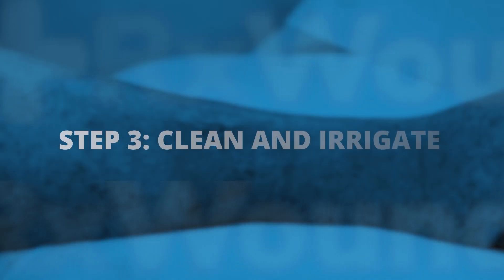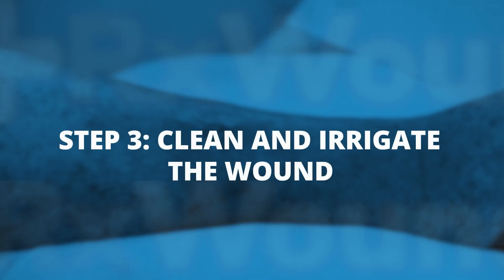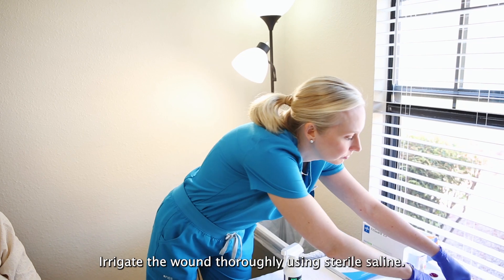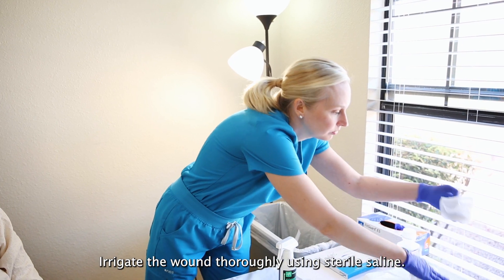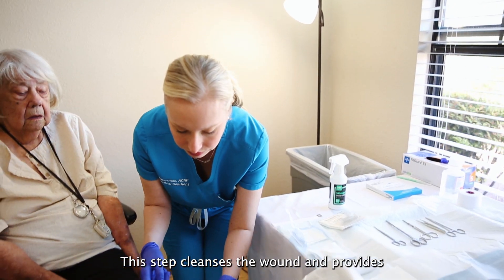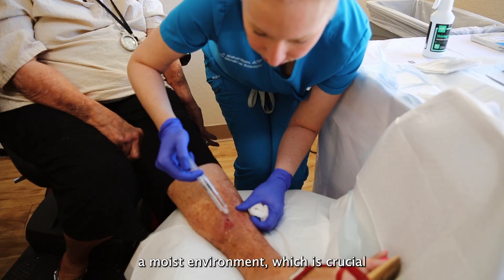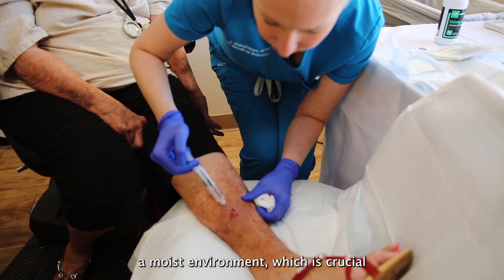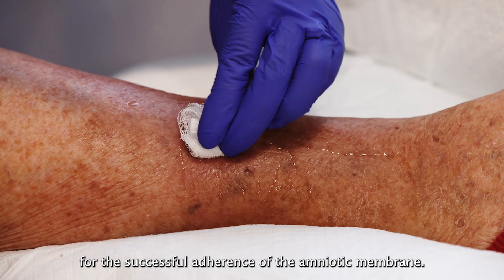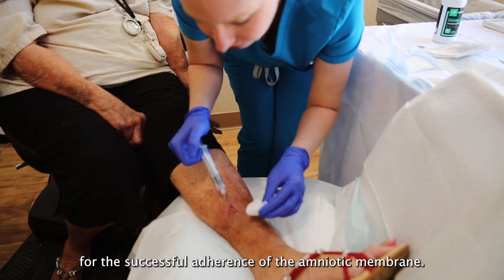Step 3: Clean and irrigate the wound. Irrigate the wound thoroughly using sterile saline. This step cleanses the wound and provides a moist environment, which is crucial for the successful adherence of the amniotic membrane.